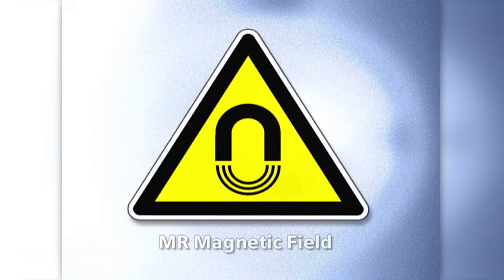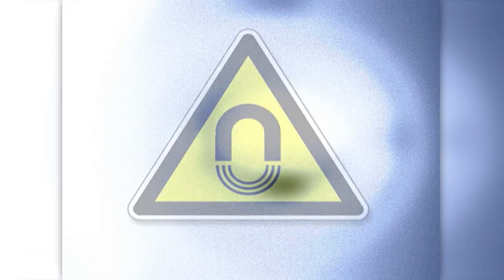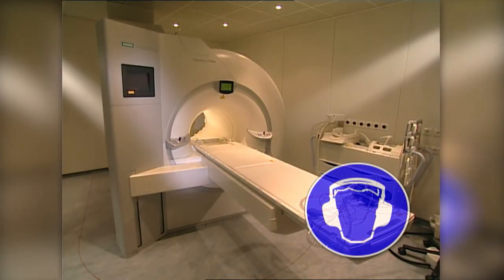The static magnetic field used in MR does not cause any lasting side effects. The same is true for alternating fields when used properly. The rapidly switched magnetic field gradients in combination with the static main magnetic field are the cause of the considerable acoustic noise created during an MR examination. Since the coils generating the gradient field are located in the static magnetic field, a sudden force is exerted on them when the current is switched on or off.